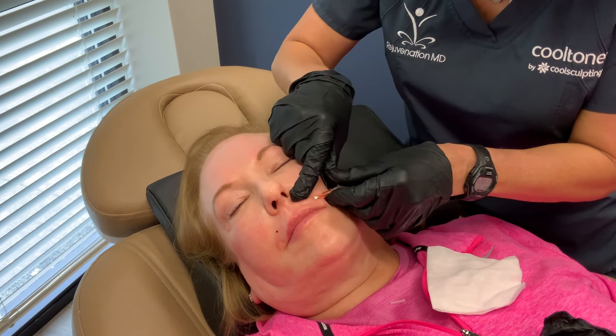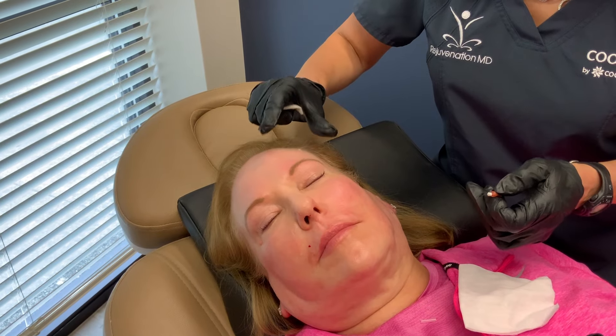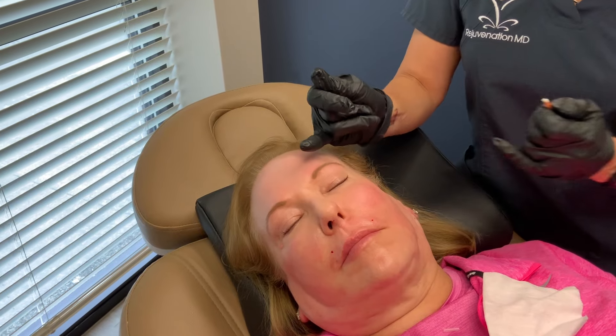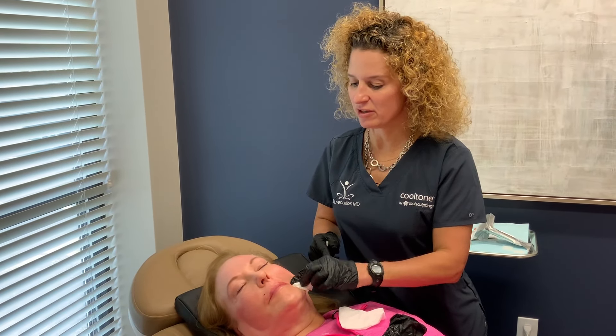I really like these for sleep lines — especially sleep lines anywhere. A lot of times people get sleep lines up in their forehead going horizontally because of how they sleep. These are great for putting into sleep lines too. You can really put these PDO threads anywhere.